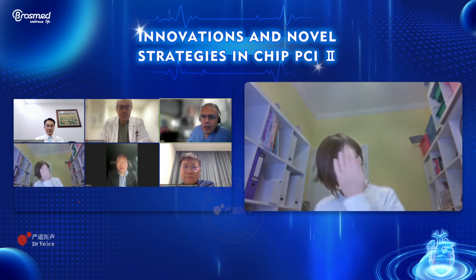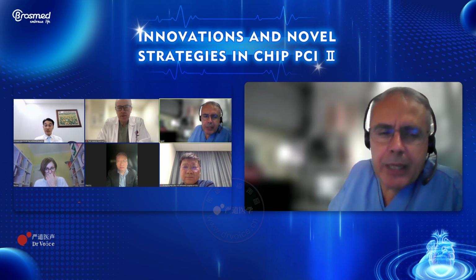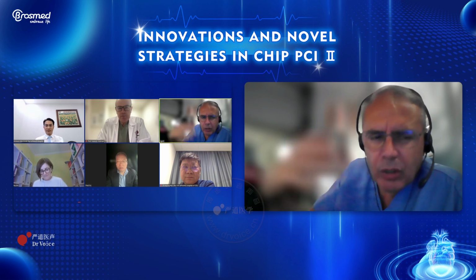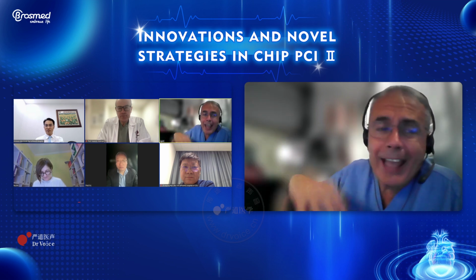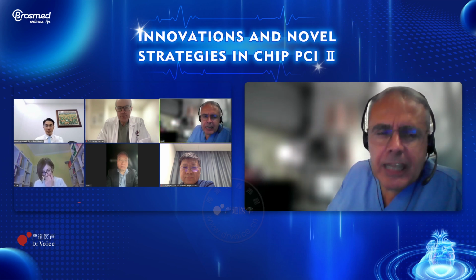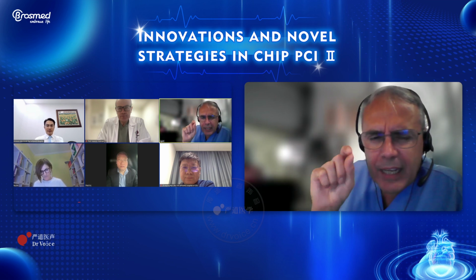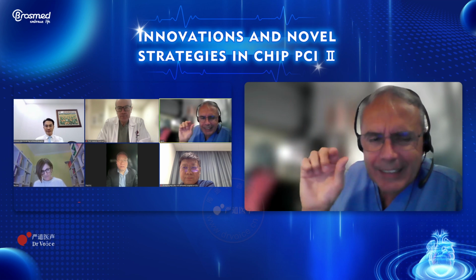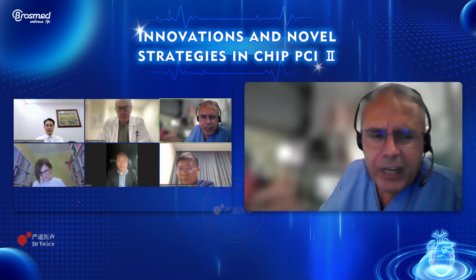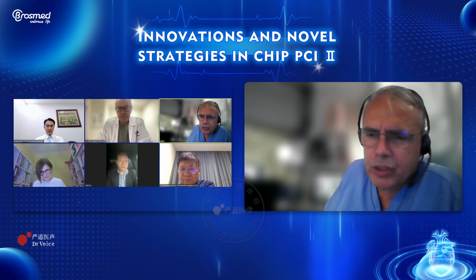So regarding this, it is an open question. Regarding your experience, I do imaging sometimes, but I have a lot of experience with Revo edge and imaging. Compared with the cutting balloon, in my small experience, I don't observe a clean direct cutting, but I see a controlled dissection. Is this your sensation, your feel, or do you see other imaging after Revo edge with IVUS or OCT?